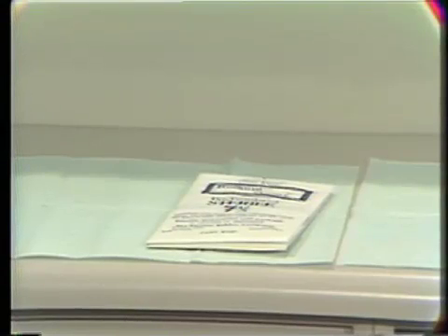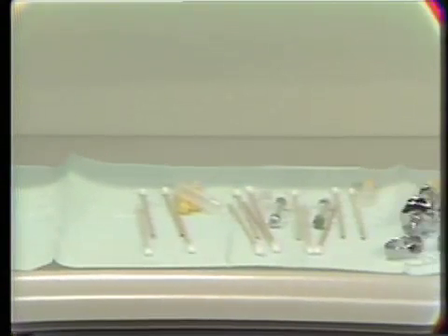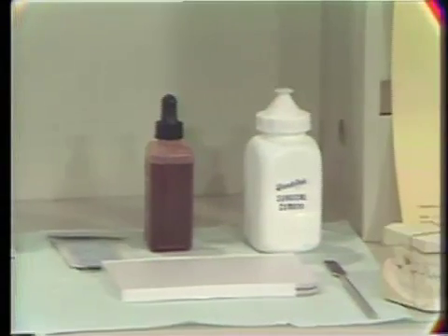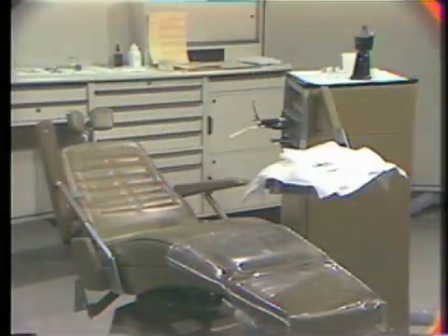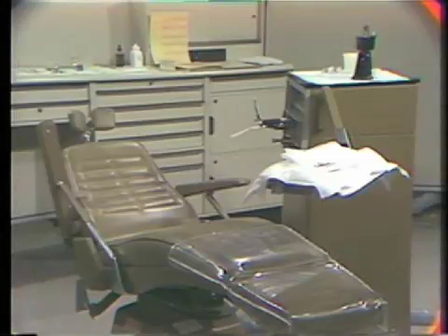On the back table, you can see the rubber gloves, the necessary equipment to administer the local anesthesia, the dressing material, the study cast of the patient, the charting and the records, and the radiographs in the view box. This is the setup of the chair and the dental unit and the bracket table where the surgical instruments are located under the sterile sheets and drape that will be used on the patient.